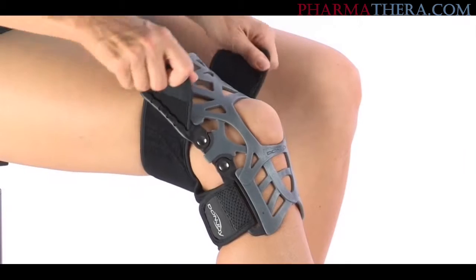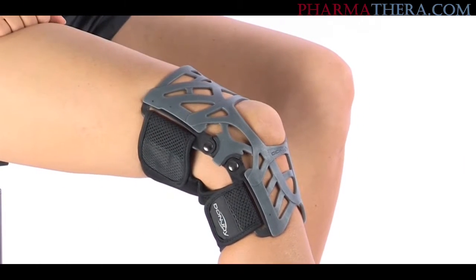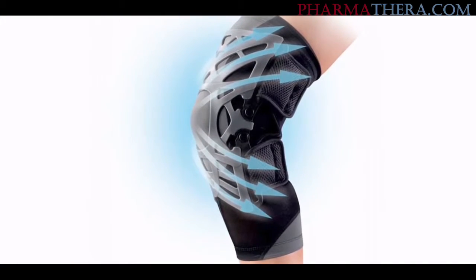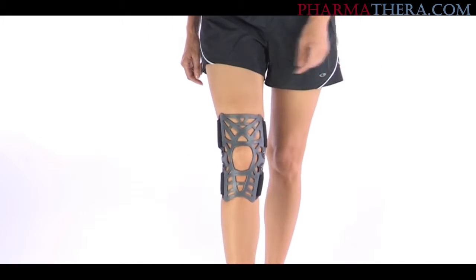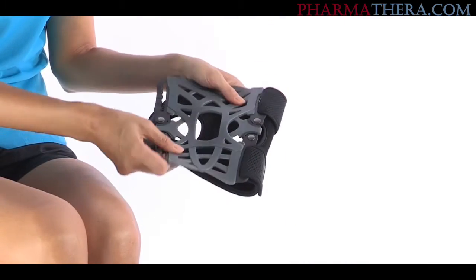Just by looking at it, you can tell the Reaction Knee Brace is really different from other knee sleeve type braces. This innovative webbing absorbs shock and shifts weight away from the painful area as it stabilizes your knee for proper tracking. The hinges work with the web, flexing as you move for added support and comfort. The open design and mesh keep it breathable and lightweight.